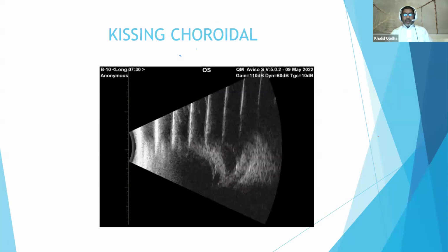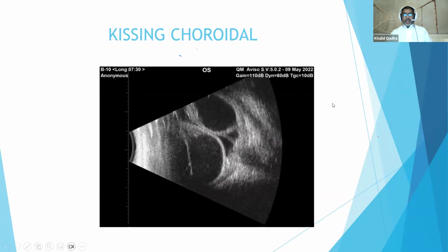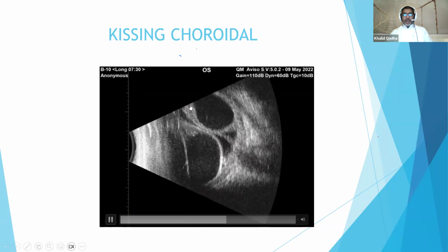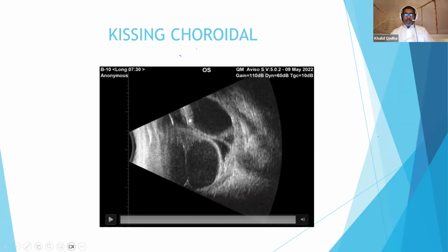This is a video about choroidal detachment. You can see this is what we call kissing, and why we say this is because it's from two sides, from, let's say, the nasal side and from the temporal side, and it's touching each other with a little bit of retinal detachment at the end here, and this is the optic nerve. You can see also here the muscle.